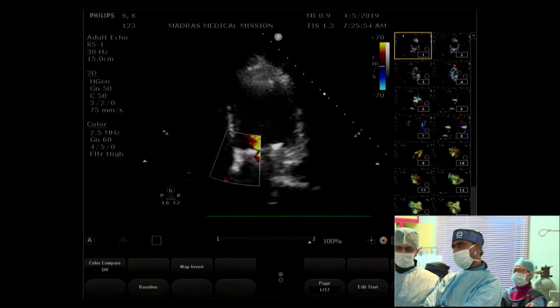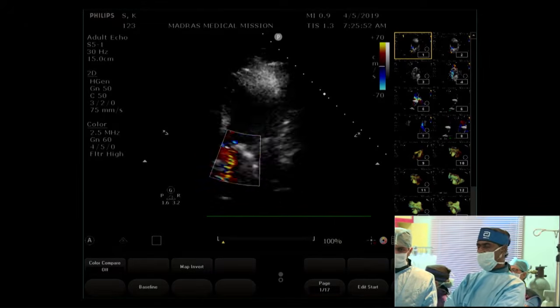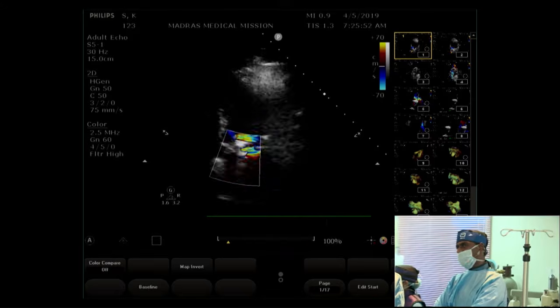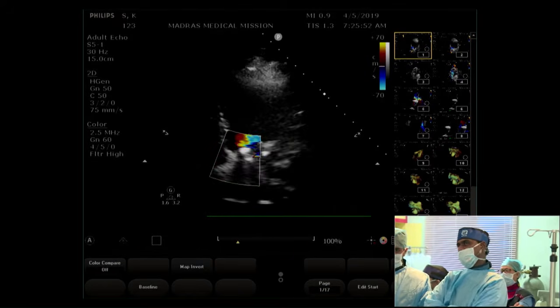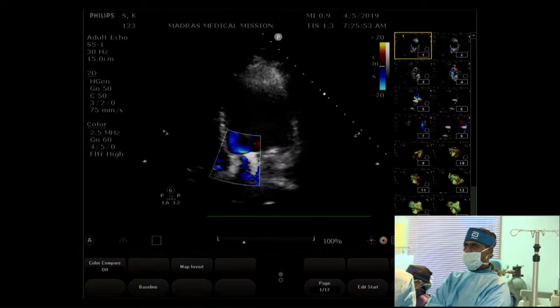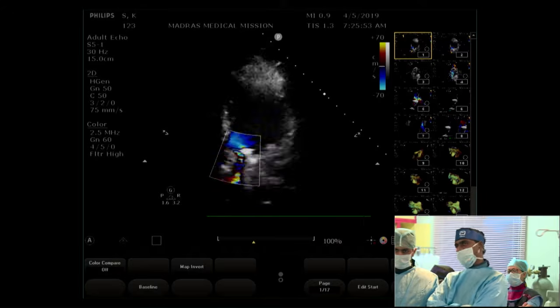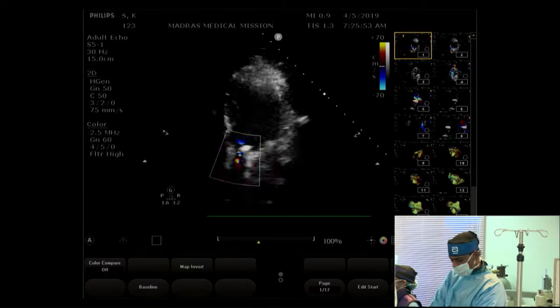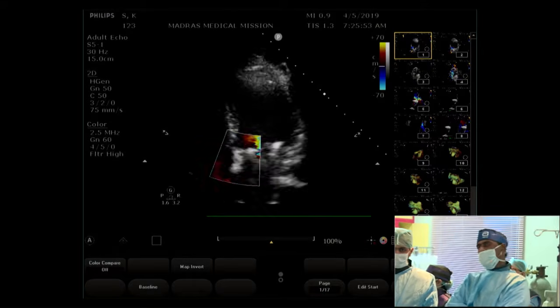Now since the leak is anteromedial, it's pretty close to the aorta, it's close to the interatrial septum, it is in the region of the right fibrous trigone. It has been our policy in these patients to try a transapical route. I heard that Dr. Gerard is going to talk on apical puncture paravalvular leak device closure. We are going to demonstrate the way we do it in our center.